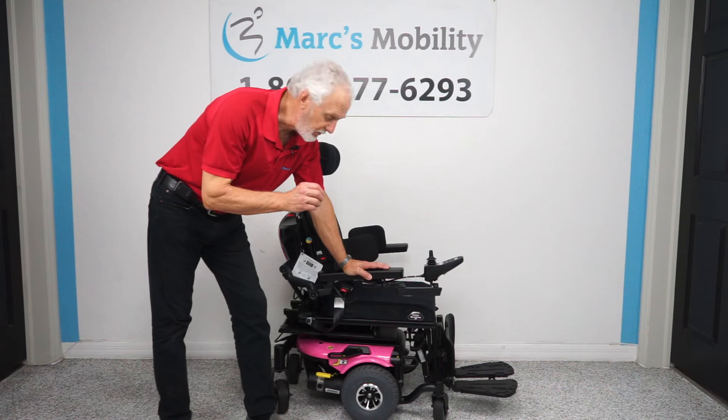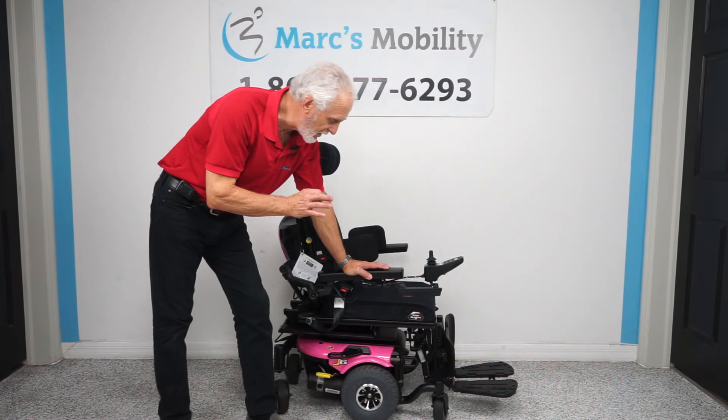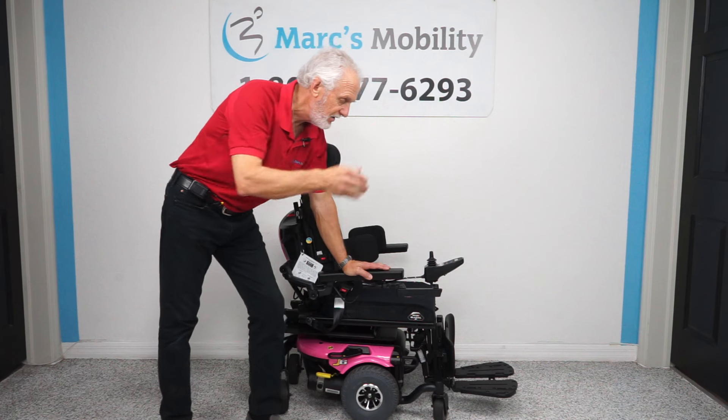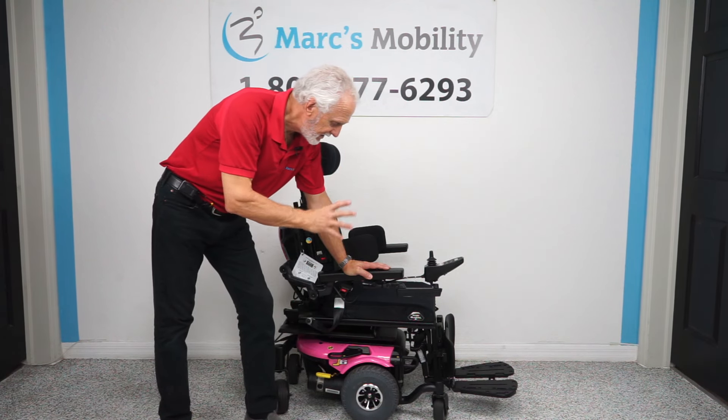Good afternoon folks, this is Mark with Mark's Mobility. We have a really nice chair here — a J6 power chair with electric tilt and electric legs. If you need to be tilted and you need your legs up, which are two of the most in-demand options, this would be a nice one.